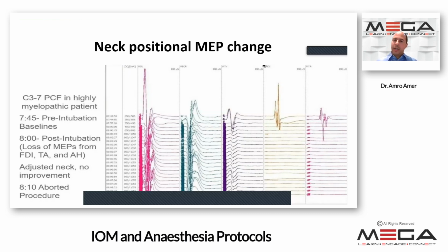And the other way of checking the position is in prone position, usually in lumbar surgery. So let's say a patient is prone and his arms are extended. So it's overextended to the top of his arm. We will see a change, and we position the arm.